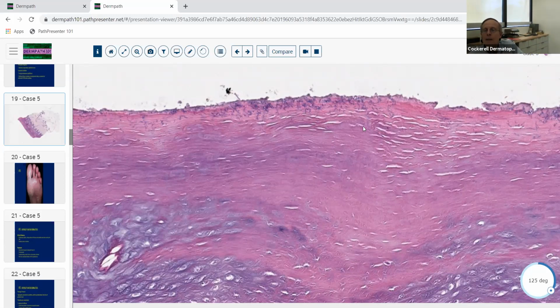Also, at this power, on H&E, these are basophilic. Usually when you look at yeast, Candida, it's really hard to even see those on H&E. You really have to look at higher magnification, and they look like little tubes in there, kind of spaces. Here you can see that they're basophilic, so that should make you think that they're filled with DNA. So we may now be looking at filamentous bacteria. Hopefully you know what the diagnosis is when you see filamentous bacteria on the outer surface of the cornified layer, growing down into the stratum corneum here.